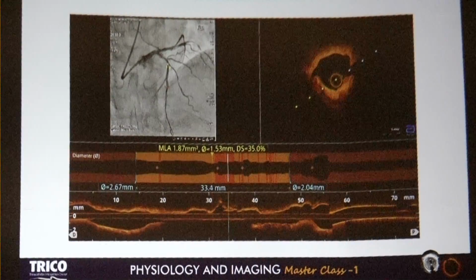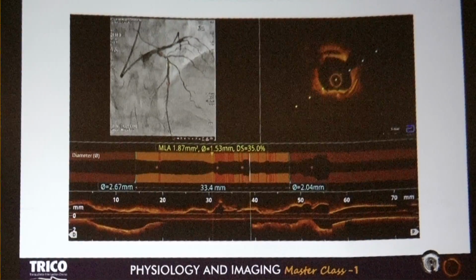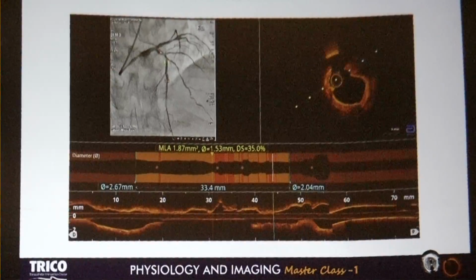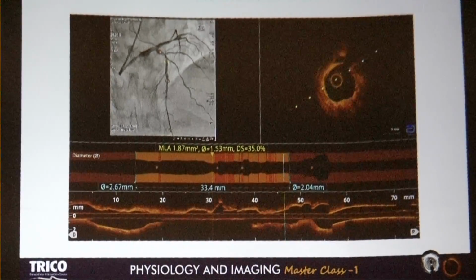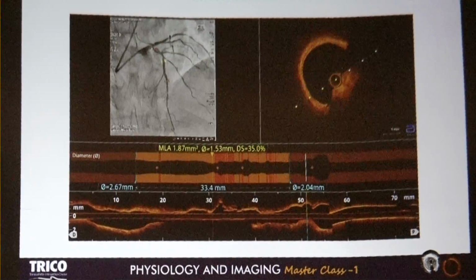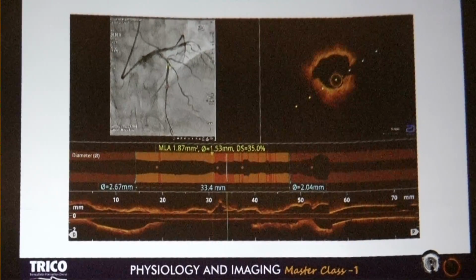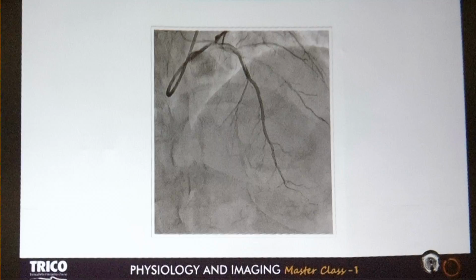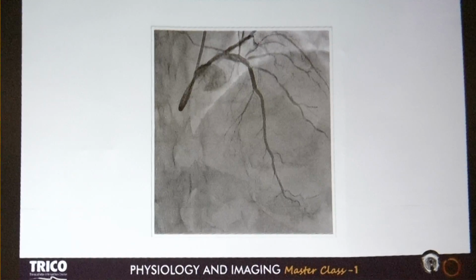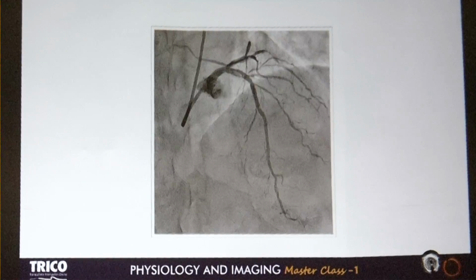It was only 30-35 minutes given to me, and all these things are to be shown. Once the rota wire came out, I had to go in again, and I spent a lot of time there. So very little time left. When I saw this OCT image, I thought, excellent, we have done good rotablation and good dissections everywhere all around, good breakage of calcium, let us stent it. And I stented, and I landed up with this thing. And I was taken aback. What has gone wrong? What is this?